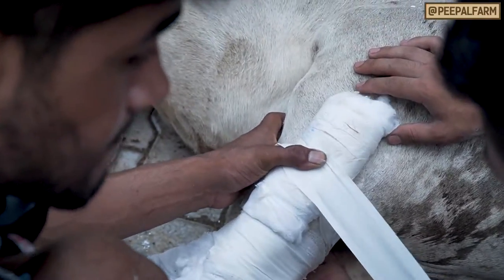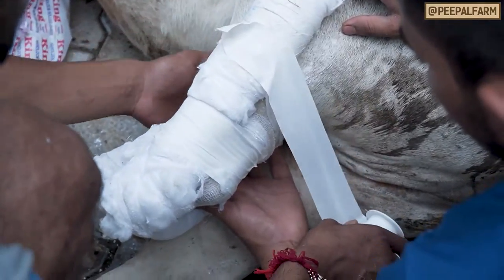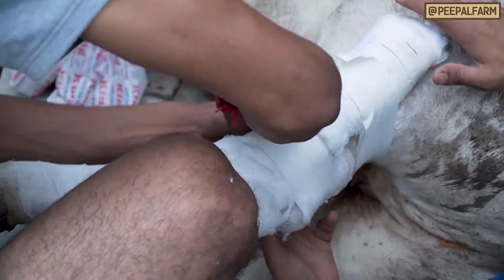Step 5: Wrap the splints in tape to hold them in place. The tape should be set in place snugly, but not pulled taut.